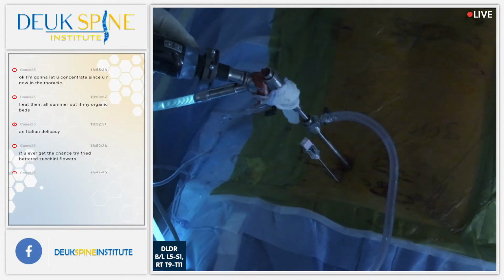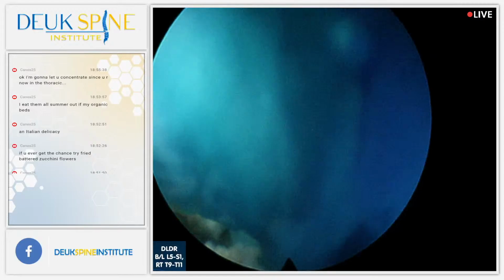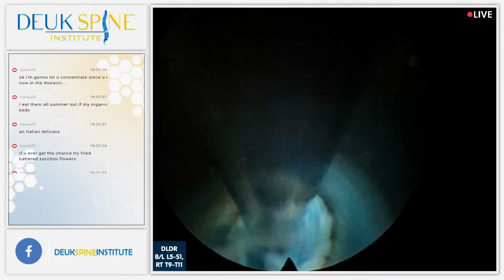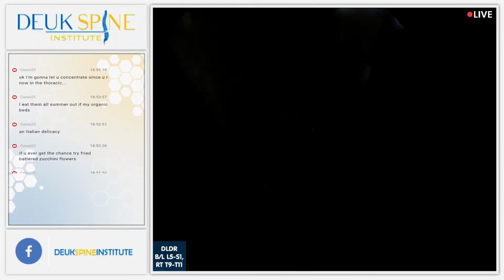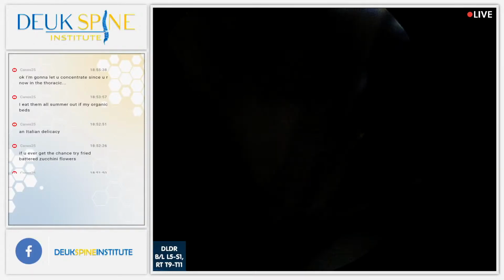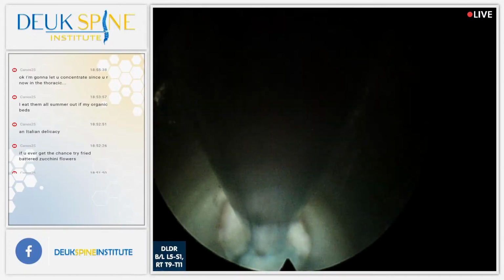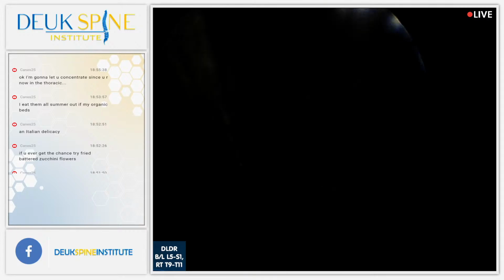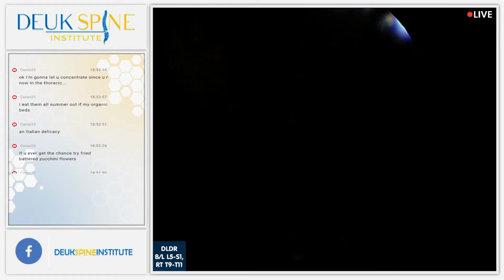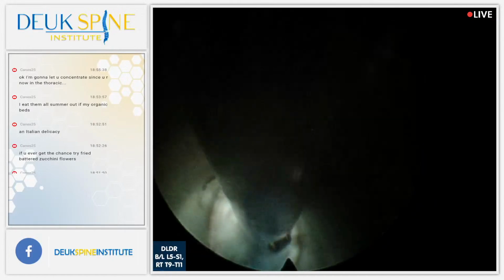Okay, you can see we're inside the disc. That's the herniation we're looking at. And we're going to take these pieces out. Look at that thing. There's a piece of herniation. So this definitely was the painful disc. When you look at his MRI, you can't really tell for sure. We had to pretty much use some deductive reasoning, testing. We got an x-ray right where his pain was. We used paper clips to figure it out. And then I looked at the MRI. It was originally read as normal. I looked carefully at it and I realized it's not normal. It's just subtle. And like most thoracic herniations or even lumbar, subtle abnormalities are what cause pain. The devil's in the details, as they say. So I'm glad we figured it out. But this is a 10 out of 10 pain for this patient.